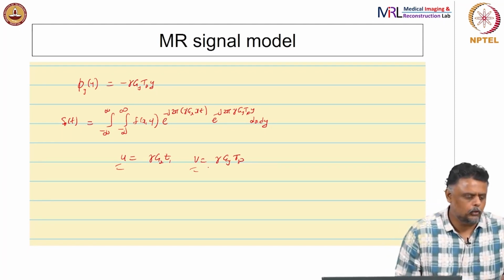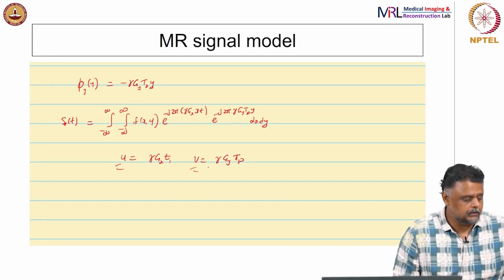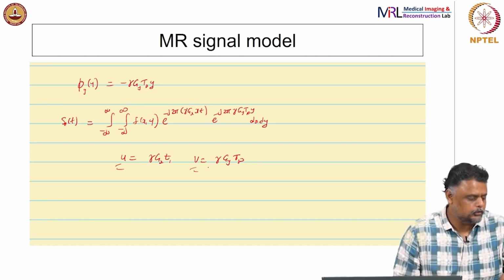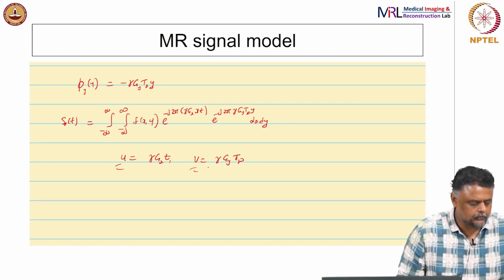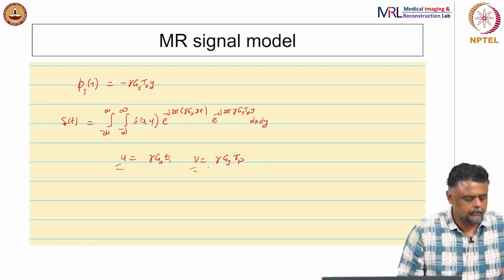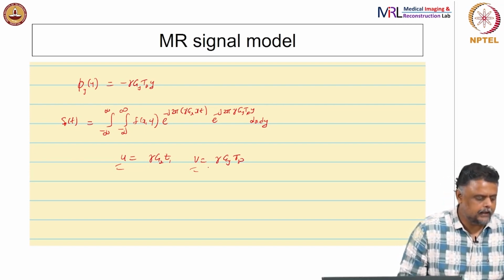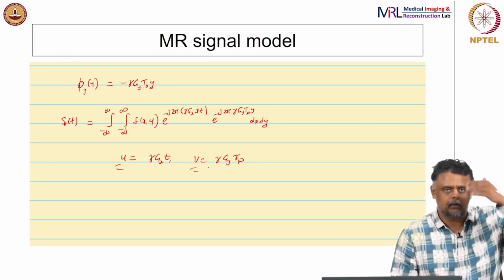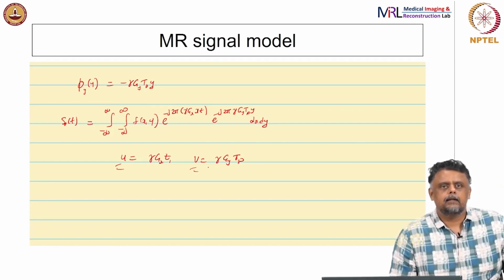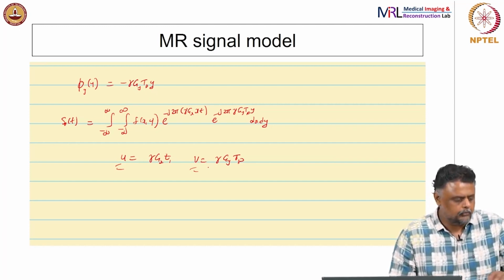So, that is typically how it is shown in all these images and pulse sequence pictures. I have not shown them here, but maybe at a later time I can show you how it is done, okay. Typically the range of these gradients is shown, because the gradient can go from some minus max to plus max, right. I have not shown that in any of these diagrams, but that is how we typically have to interpret it.